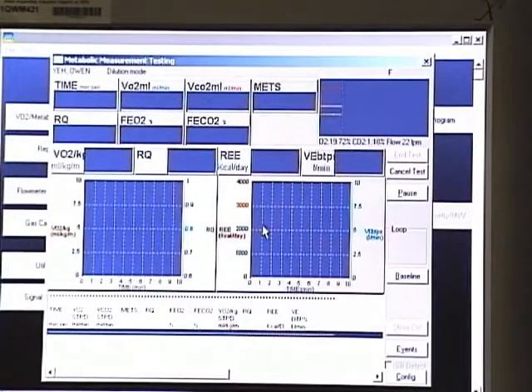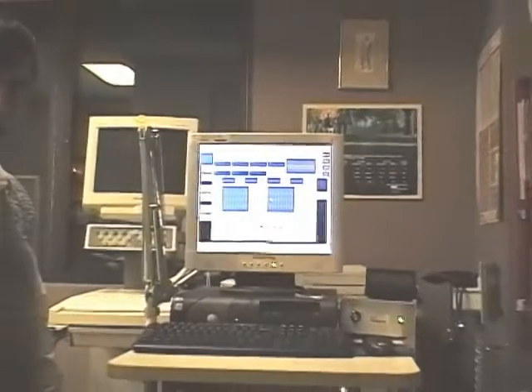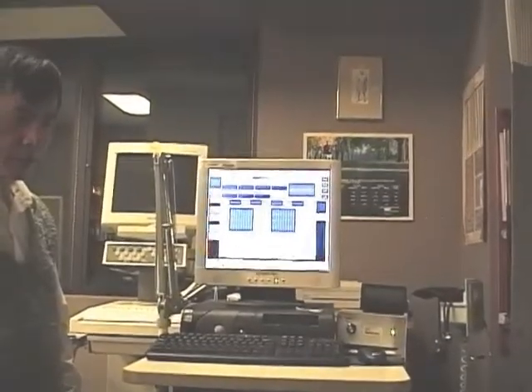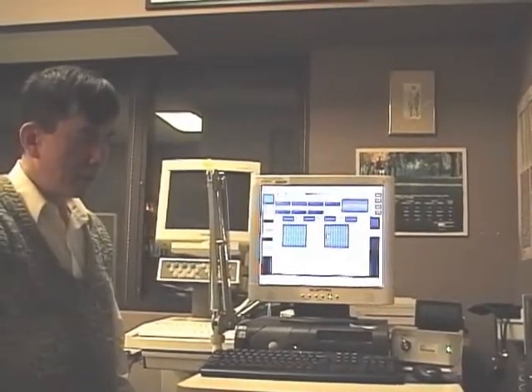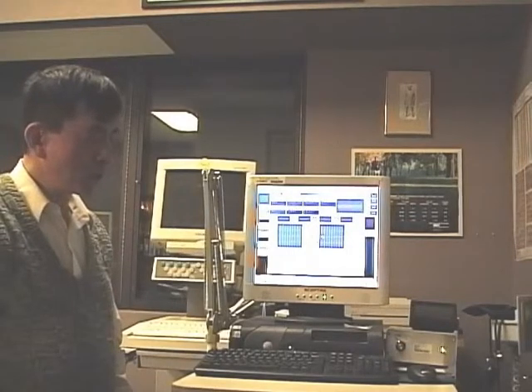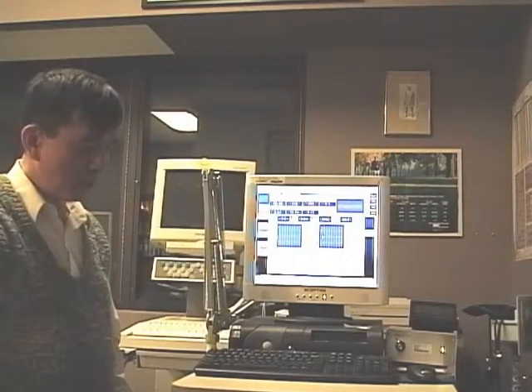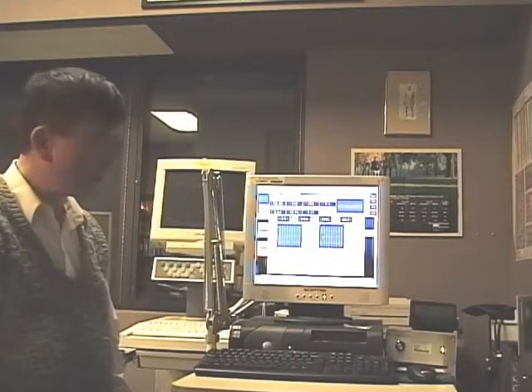Usually, the canopy measurement, we perform that early in the morning. The subject should fast for 8 hours, not eating anything except water. And the subject, if they come in the morning, they should rest for at least 20 minutes. The better way would be that they stay overnight in a clinical research center setting, and in the morning move the metabolic cart close to their bed and measure the resting metabolic rate.